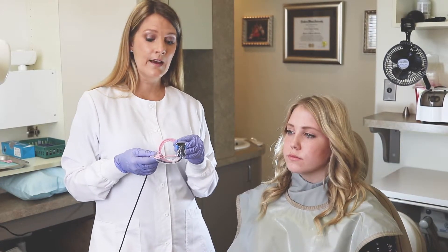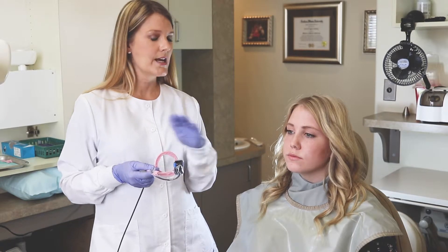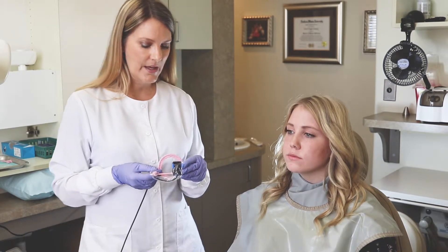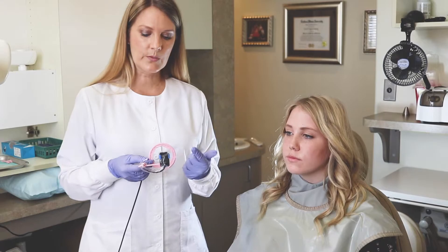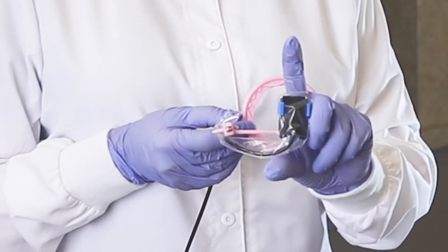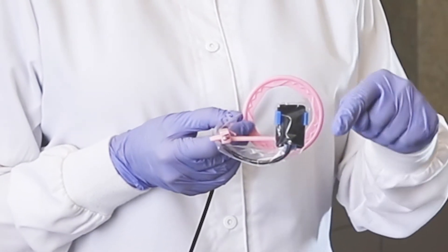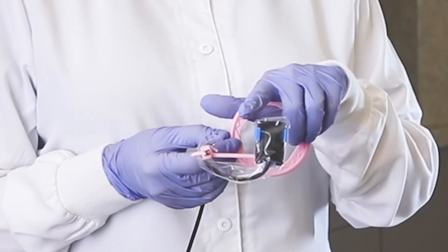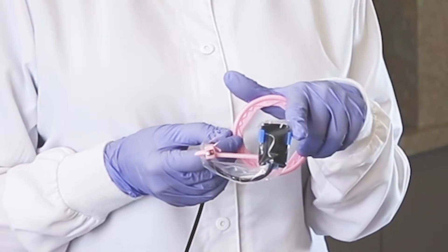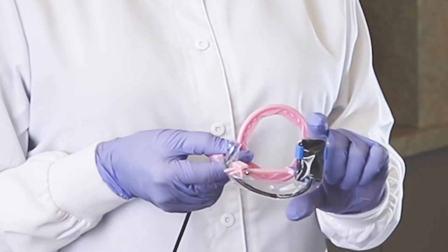Hi, my name is Susan and today I'm going to teach you how to catch the apex of a canine in almost all situations. One of the things you'll notice is that the click ray anterior bite block does not grab the sensor from the top like a lot of other bite blocks — it actually grabs it around the middle, allowing your patient to close down on the rounded edge sensor.